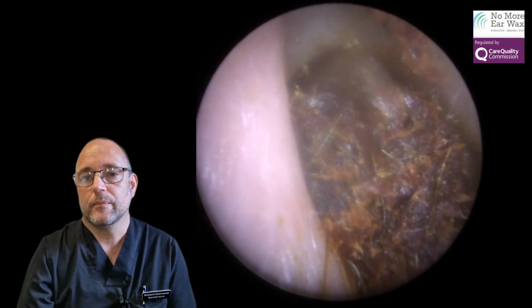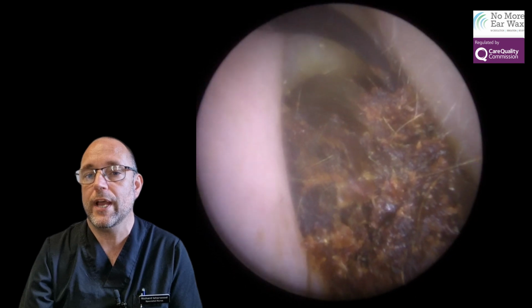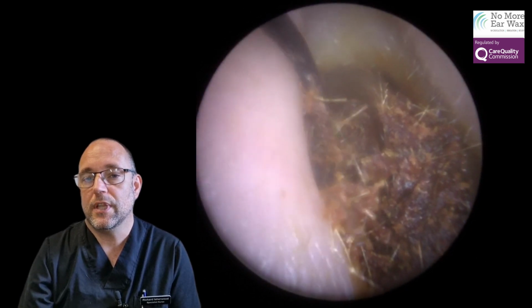Almost. But with each little pull, it is coming slowly forward. So again, we can see we've got another little good gap there. So I'm going to try and really dig it in. But again, it's just slicing through it.